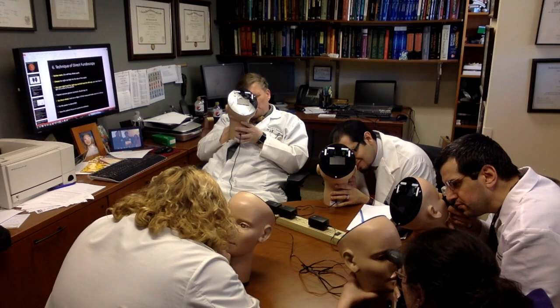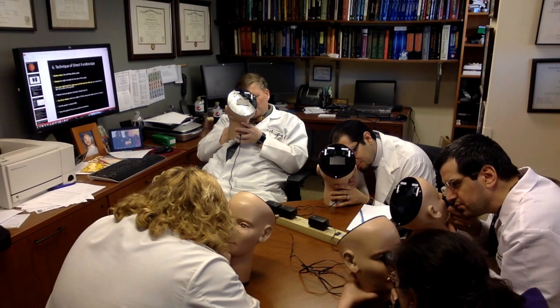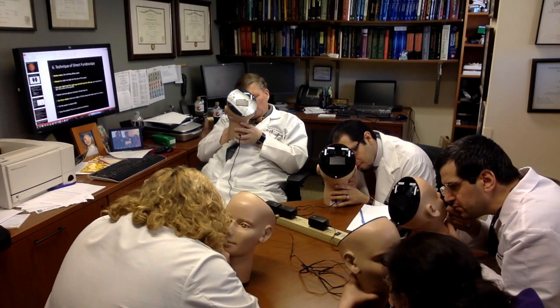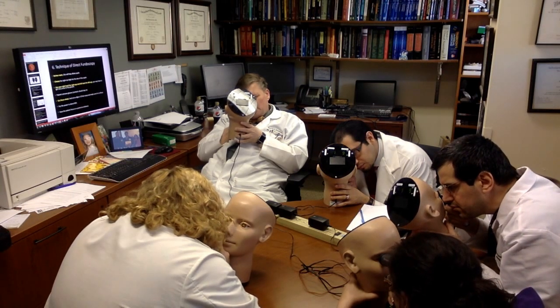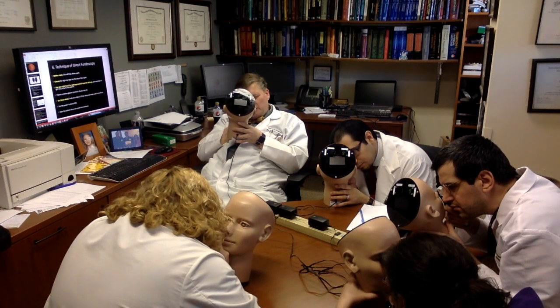All right? So this is the normal optic fundus. As you can see, the disc borders are reasonably sharp, especially on the temporal margin. It's very sharp. You see the cup. You can see the color of the disc, how it's different than the cup. You see the arteries and veins that leave. They go up temporal, up nasal, down temporal, down nasal. And if you look directly in the middle, you'll see the macula, which is pigmented.